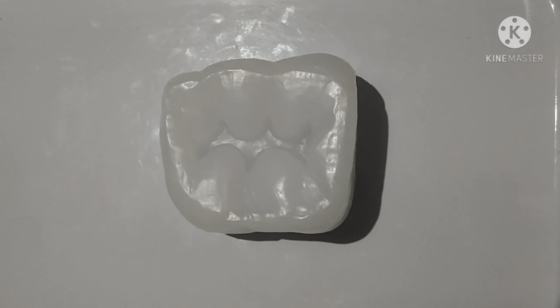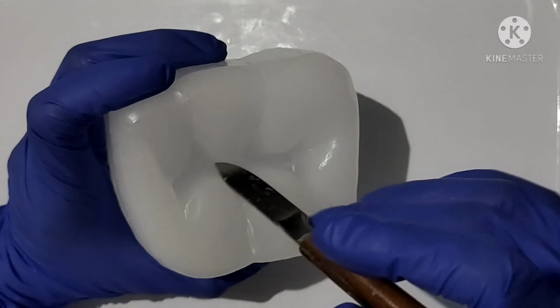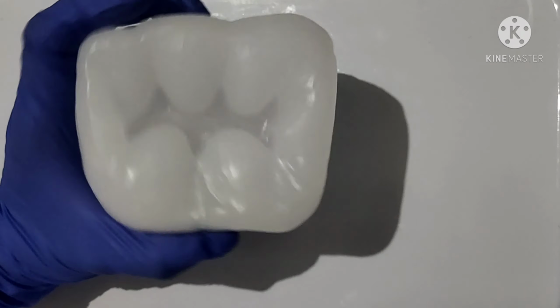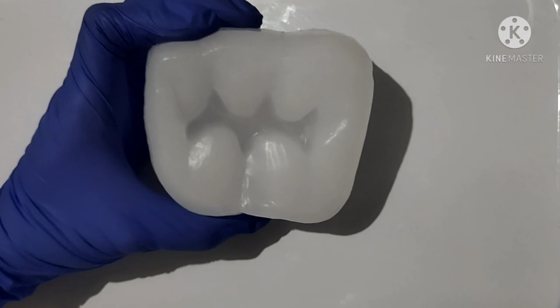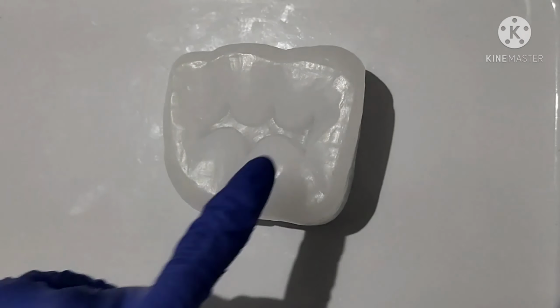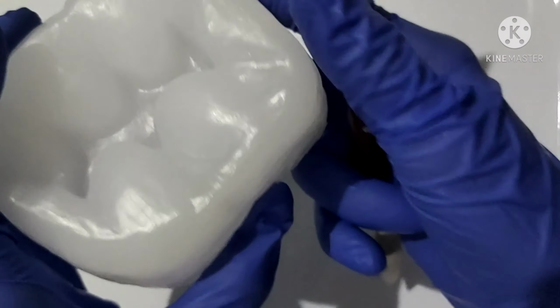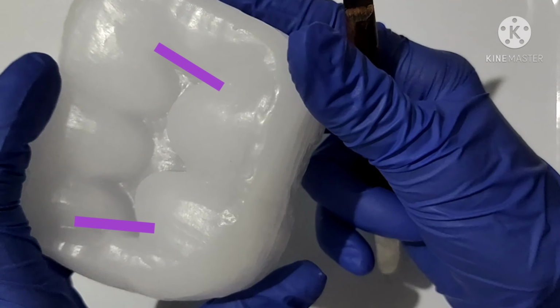Step 1. Outline form. When you do this on a typodont or real tooth, the cavity depth should be 1.5 to 2 mm. But here, it's just an estimate because, as you can see, we have a big carving here, so we cannot apply it here. The mesial wall and distal wall should be slightly diverging to have dentinal support of the marginal ridges.